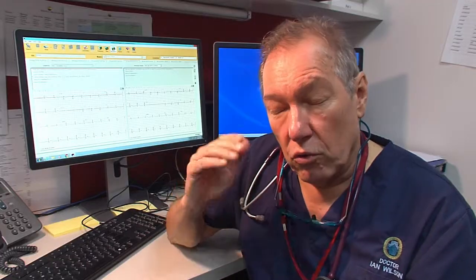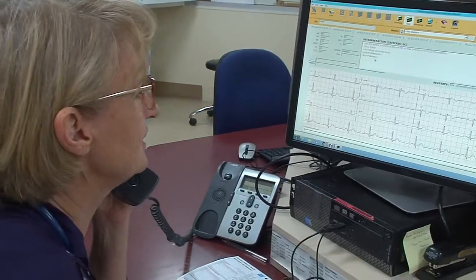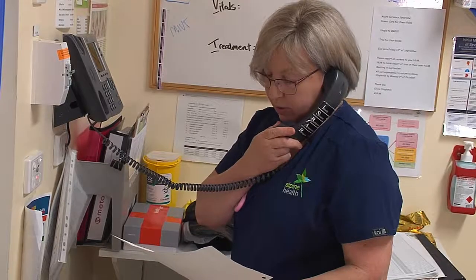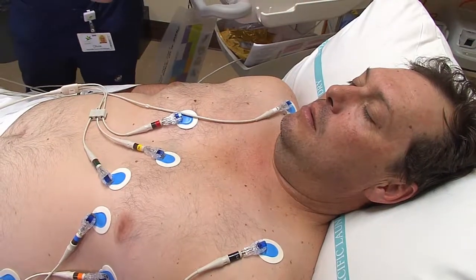The one that we're all aware of is, could this be a STEMI? So this patient, you look at the ECG, you hear the clinical story of crushing central chest pain, you're saying they're going to need thrombolysis. In which case you're going to advise the doctor or the nurse to actually call Ambulance Victoria. They'll then come and retrieve the patient, and if they haven't given thrombolysis there, they'll actually thrombolyse the patient themselves, and they'll organise transfer to a tertiary centre.